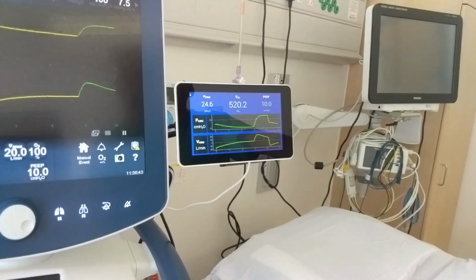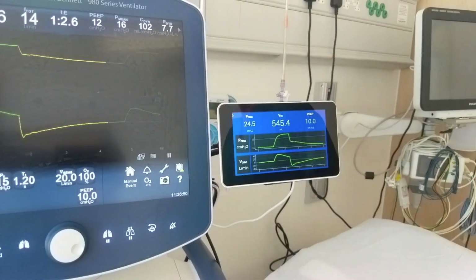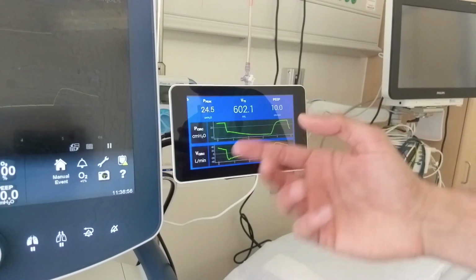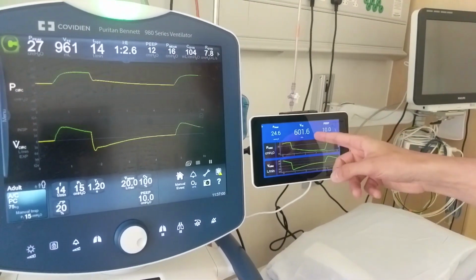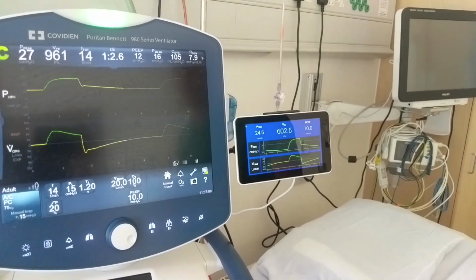As I've said, we know that if we increase the pressure that's driving the entire system, we want to protect the patient on the lower end. We can see after a couple of breaths then the effect of increasing the pressure inspired to 15 centimeters of water is that this patient B is indeed getting their tidal volume requirements of around 600 mils per breath.